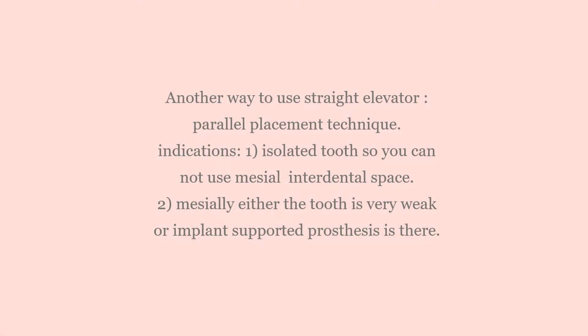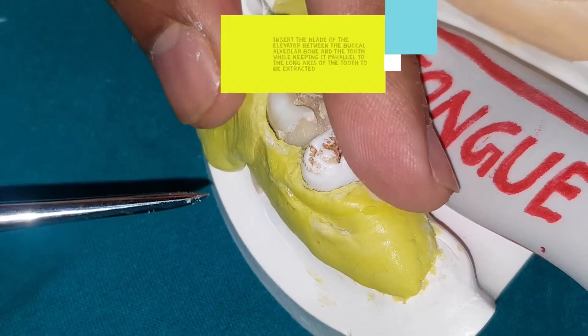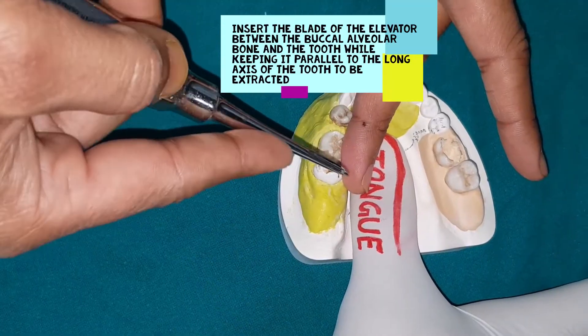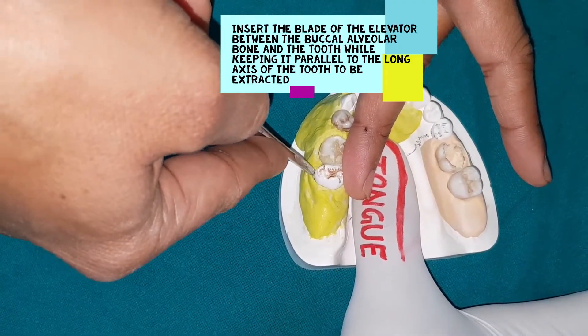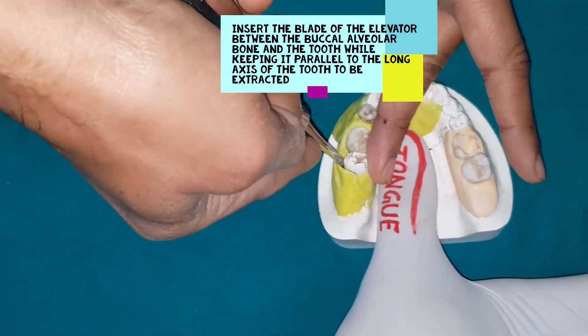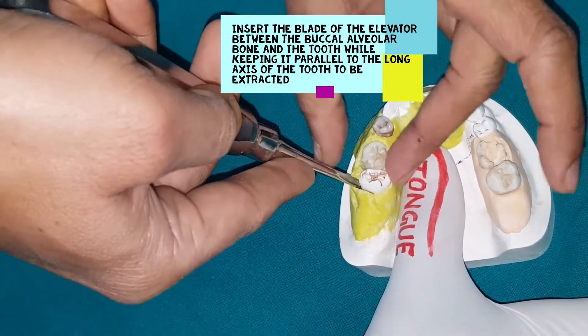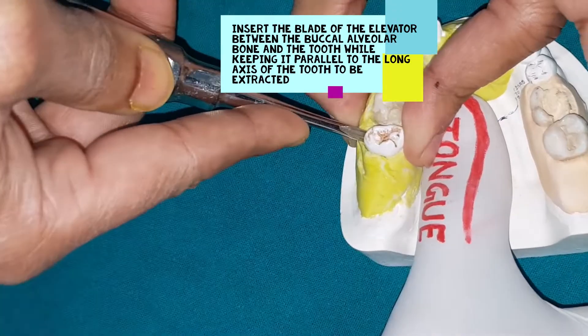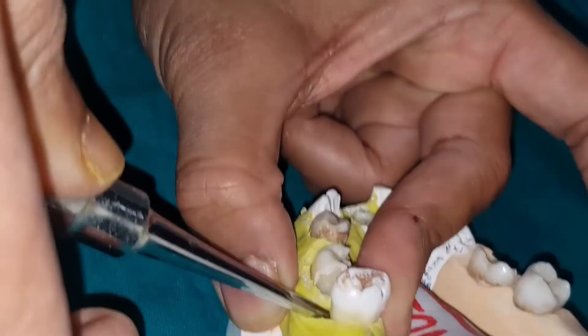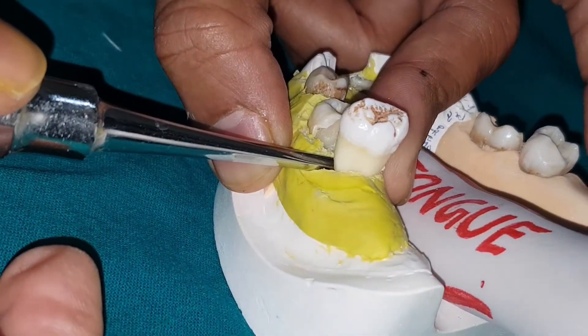Another way to use the straight elevator: many times it is not possible to approach mesially. In that case you can use the parallel placement technique. This technique is used when an isolated tooth is present, when the mesial tooth is very weak, or when an implant-supported prosthesis is there. The grasp and support remain the same. Place the elevator parallel into the buccal alveolar bone space.